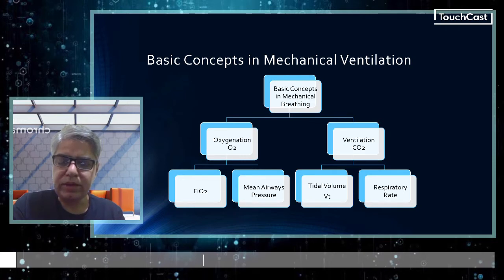So we should be using as close to the physiological FiO2 that a person uses as possible. So we should be using somewhere around, let's say, you can use anywhere from 24 to 50-60%. But high levels of FiO2, though you can use it for a short period of time, in the long run they are always toxic to the lungs, and they can induce lung injury like fibrosis or pulmonary hypertension.